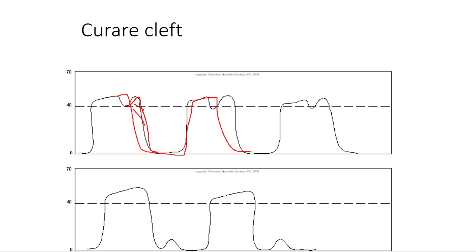Let me just shade that in a little bit. A little bit of respiratory effort. This part right here is the patient's own respiratory effort that just happens to be in synchrony with your ventilatory rate by some random happenstance. So this little notch, what you're seeing here, is all the patient attempting to breathe on their own.